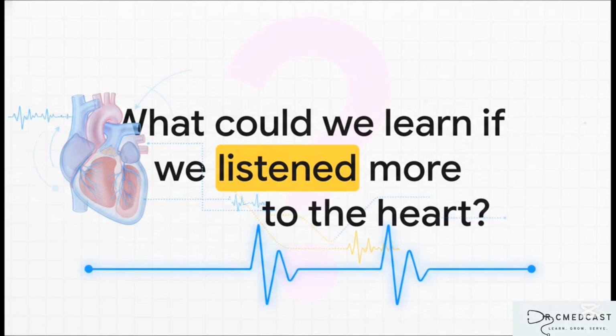It's a translation. It takes the heart's fundamental electrical nature and turns it into a visual language, a story about its health, the strain it might be under, and any disease present. And as we get better and better at reading and interpreting this incredibly detailed language, it leaves you wondering, what other secrets is the heart just waiting to tell us?